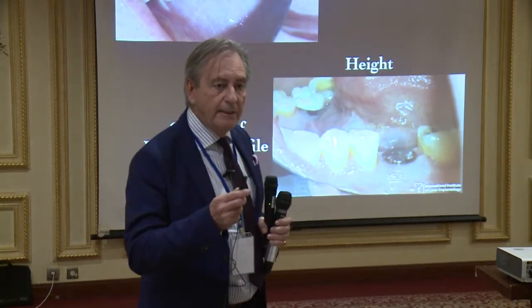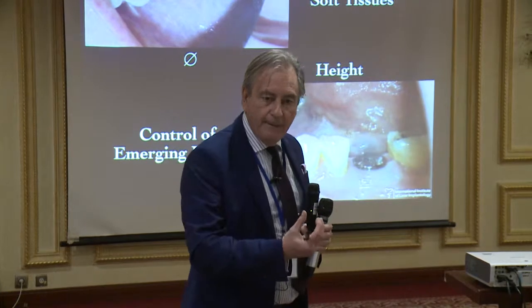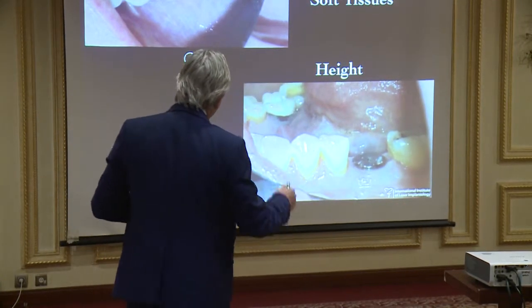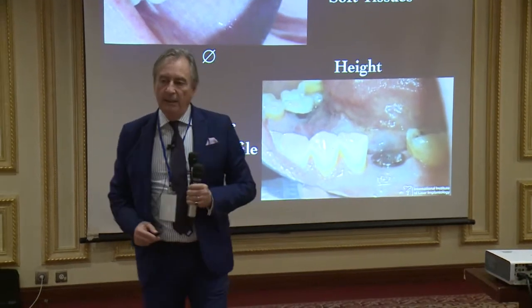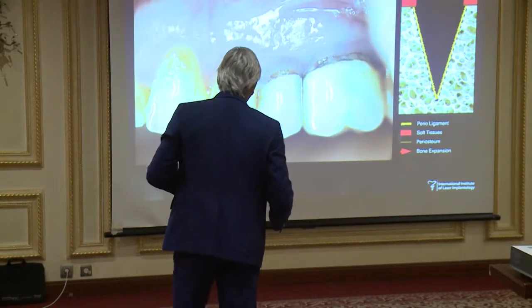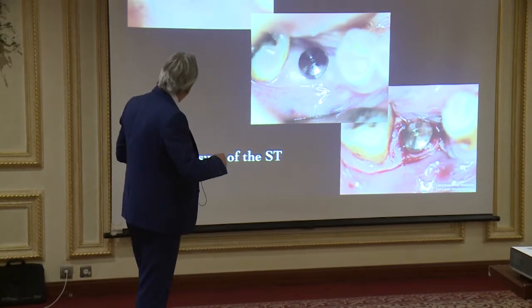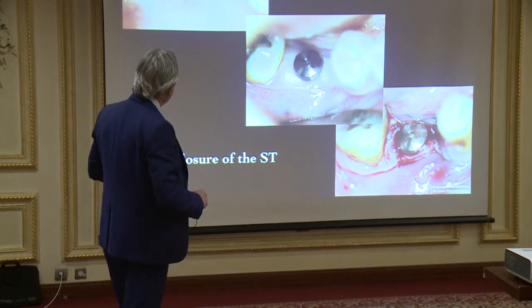Remember that very often we are facing a problem of a gap, of a leakage. So these come from different surgeries, two-step in one, and this is the healing cap, with the choice of the healing cap by the diameter and the height of the healing cap.